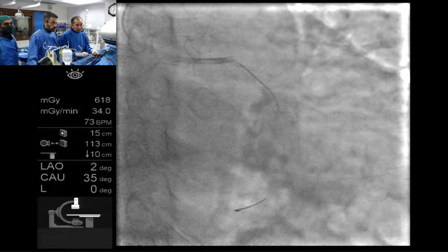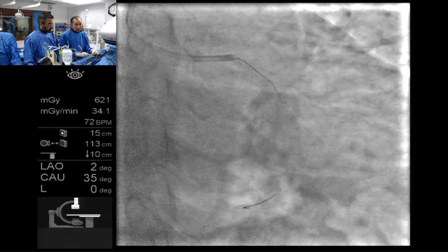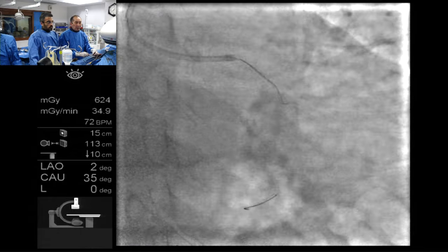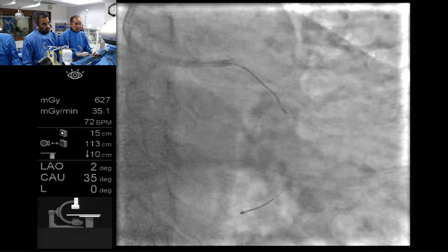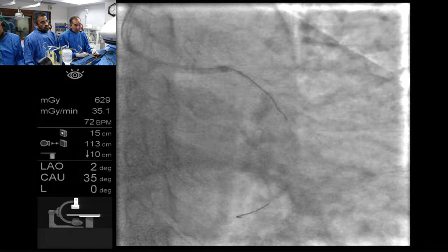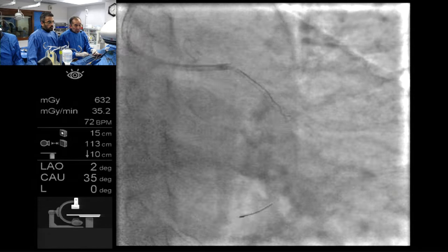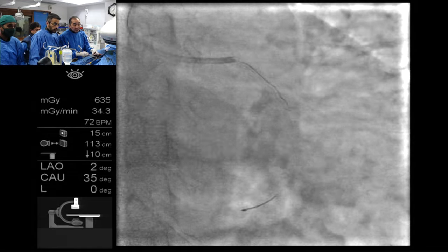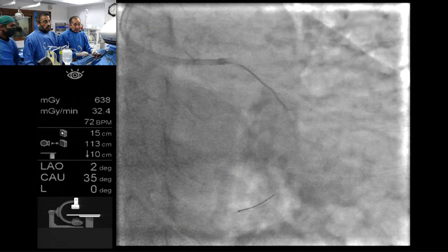Tak, just going back, you had crossed earlier into the OM. Do you find any utility in using OCT in the main branch, if you're having trouble getting across with a balloon, to confirm where you've crossed? Yes, I think that's a good idea. We might do OCT at this time if I cannot cross it, or I have a couple more tricks. I think we go for the stent strut, I think.